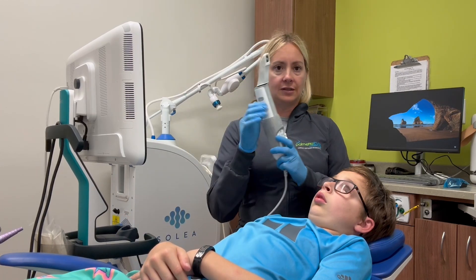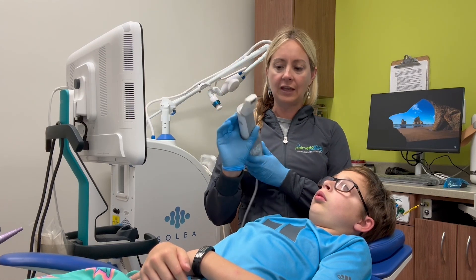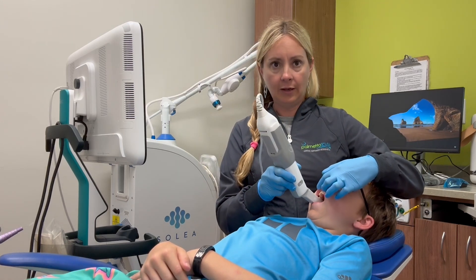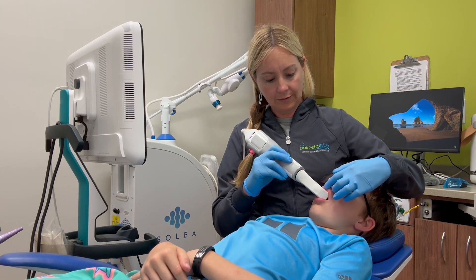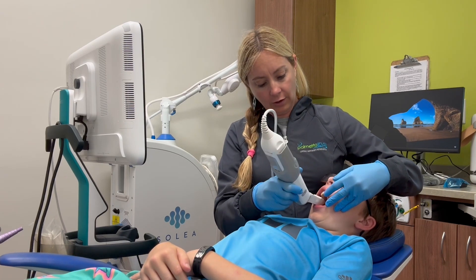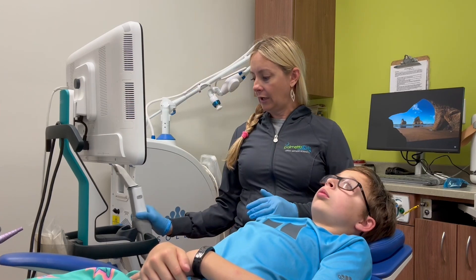It's pretty quick. It's literally this little wand-looking thing. Each person gets their own tip that switches out. Then we just go in — open for me, love bug — and we do the scans: the front, the backs, and then the same thing on the bottom. Once we do all that scanning, it pops up on our screen.